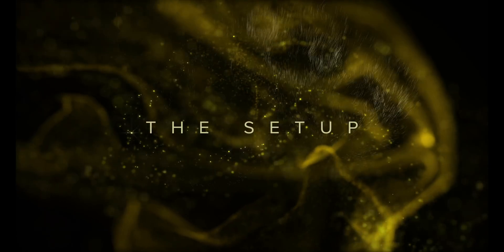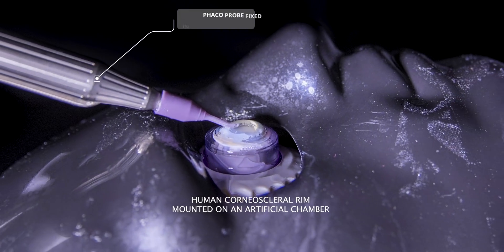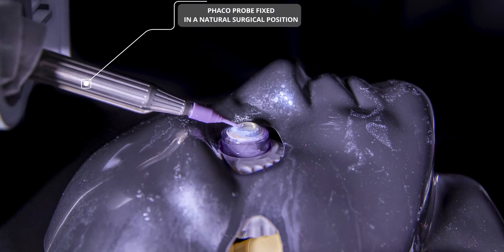The setup. To improve the accuracy, we use a human cadaveric corneoscleral model and to reduce variables, the phaco is in a fixed static configuration.